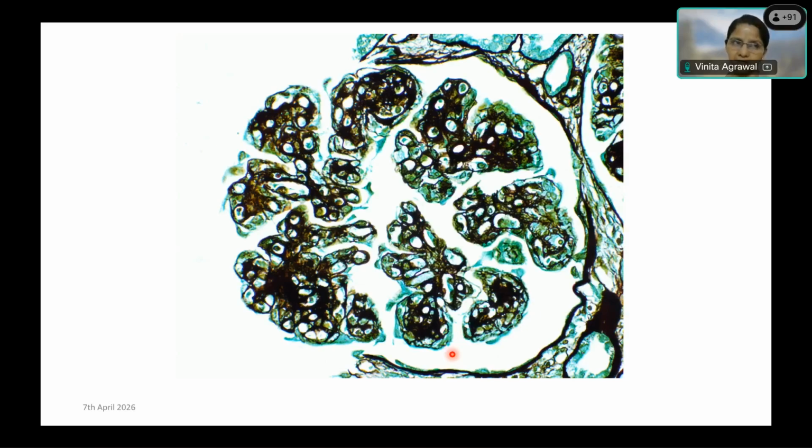Global. MPGN pattern. Very good. The pattern is MPGN, that is membranoproliferative glomerulonephritis pattern of disease. So now you've made a diagnosis of MPGN pattern of disease. Now you move on towards your immunofluorescence and try to look for the pathogenesis.